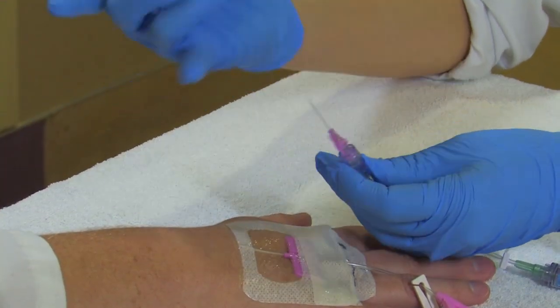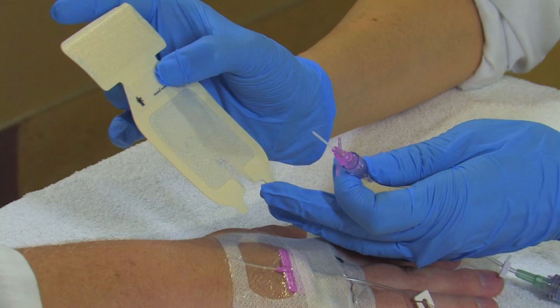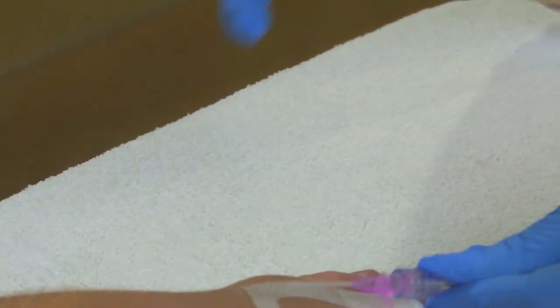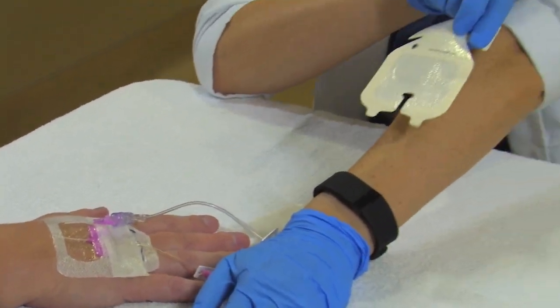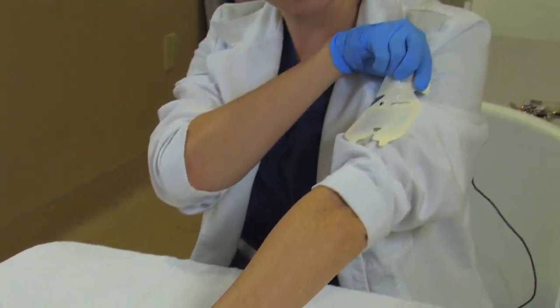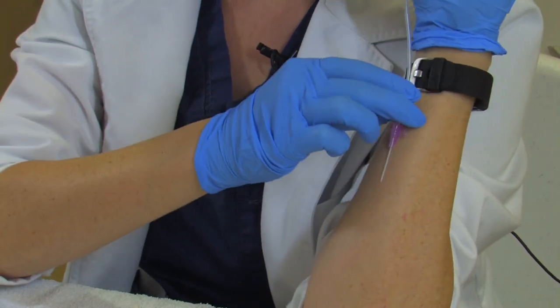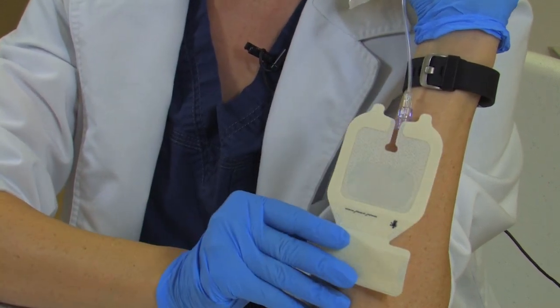So this notch is supposed to cover the colored part of the catheter, and these are the fingers. So if you think about it, after you've inserted your IV, it's fingers to fingers. So if you were to insert an IV here, it's still fingers to fingers.